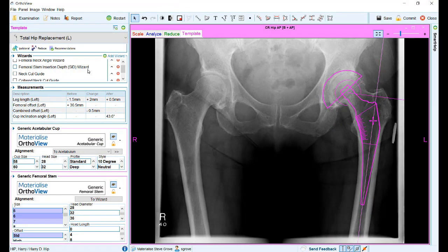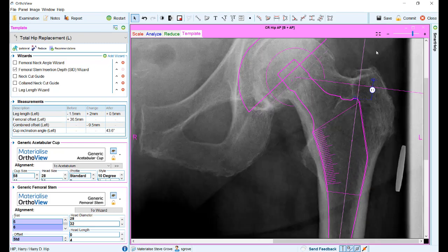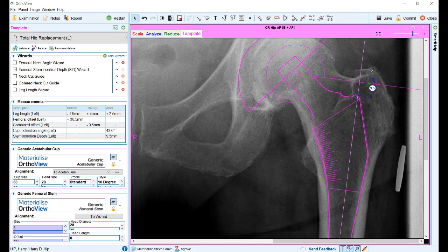In the templating stage, we have added a new wizard called the femoral stem insertion depth wizard. This provides an alternative measurement to the collared neck cut guide to mark stem position. Once activated, this wizard will be automatically attached to the top of the femoral stem, and a manual point allows for marking of the greater trochanter or any other preferred landmark to measure the stem insertion depth.